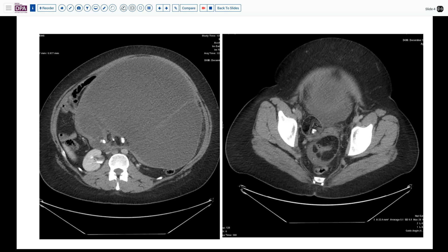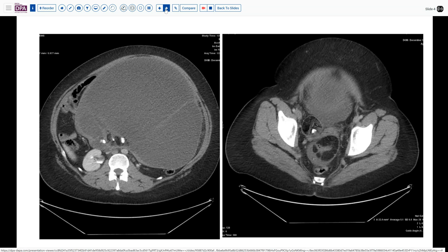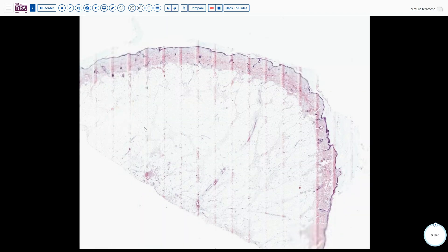Bilateral pelvic ovarian masses with areas of calcification in a young woman — we would certainly think of teratomas, which can occasionally be bilateral. In this situation, that appearance mandated consideration for frozen section analysis, and such indeed occurred.